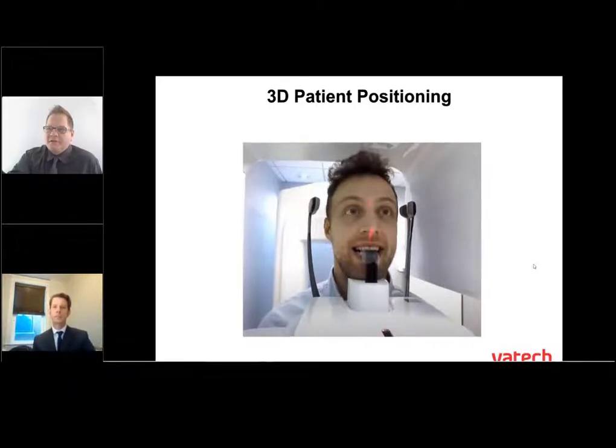Yeah, absolutely. Just to recap, we're focused on that mid-sagittal line once the patient's in there. Just like the pan, biting on the bite stick, I like to double check that. We want that mid-sagittal line right down the center of the face; tilt the head if that is off. We want it right through the two points, the eyes and the philtrum. And then when we look at our horizontal light, if you have your G1 machine, you may raise and lower that as necessary. If you have our G2 device, that's fixed. So we like to look at that for a flat plane reference and have the patient smile. You want the occlusion as flat as possible, and to adjust that, raise and lower the machine so we get that nice upper arch parallel with the floor.